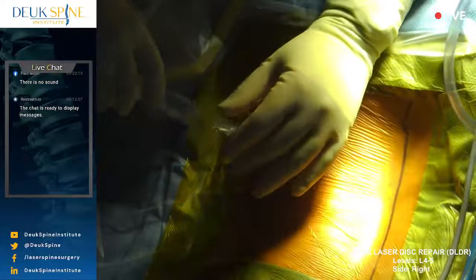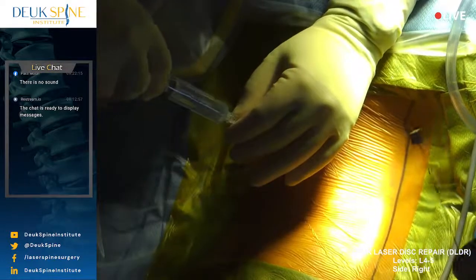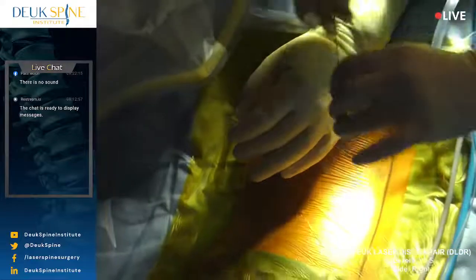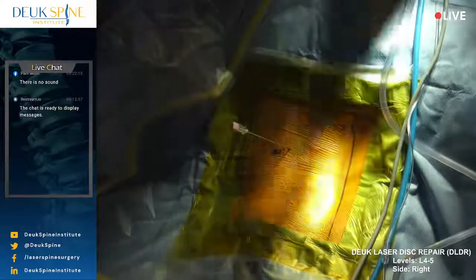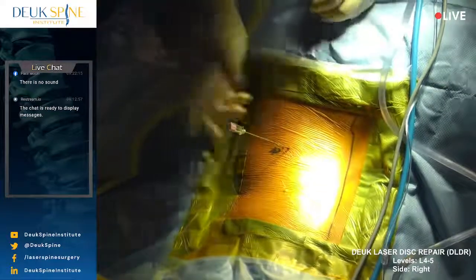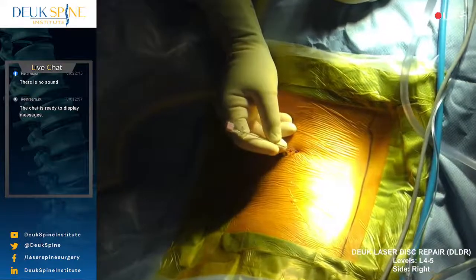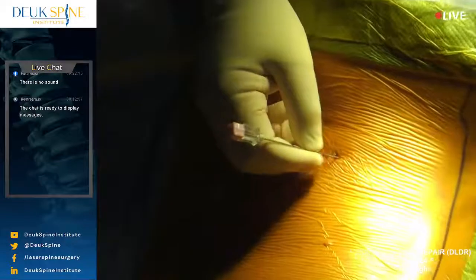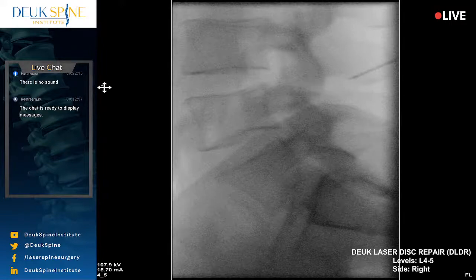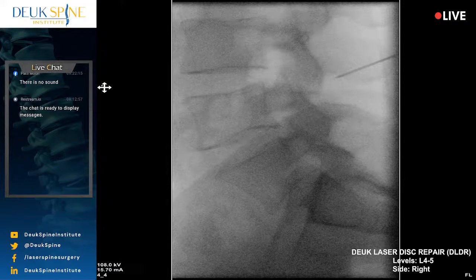So because our patient needs to be awake for the beginning of the surgery for me to do everything I need to do, most notably the discogram and navigating past the nerve root at the foramen. Those are the two important things I have to do. And because of that, I need the patient's assistance to do it. You're doing fine. I promise. Shot? All right. Good. All right, just give me a minute. I'm working on what I've got to do. You're doing fantastic yourself. Just lay still.